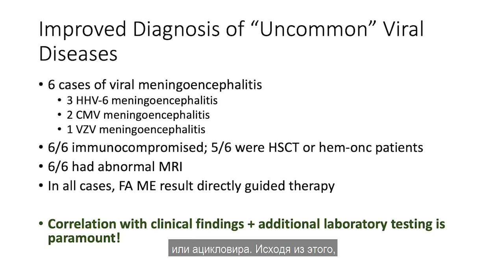So with that, it is very important to correlate the clinical findings and other radiographic findings with the FilmArray panel to determine if these are true cases.